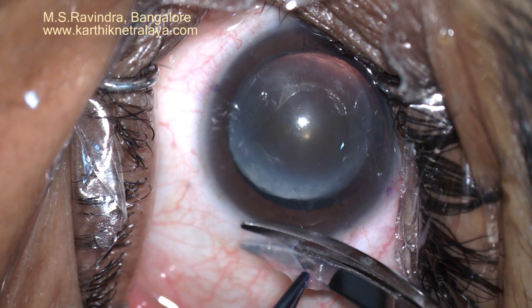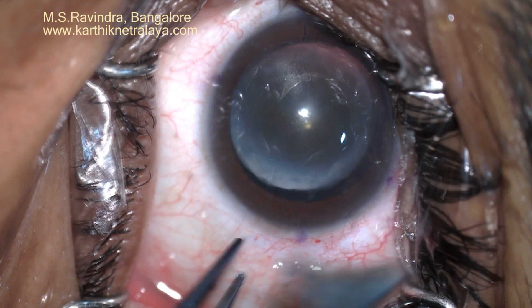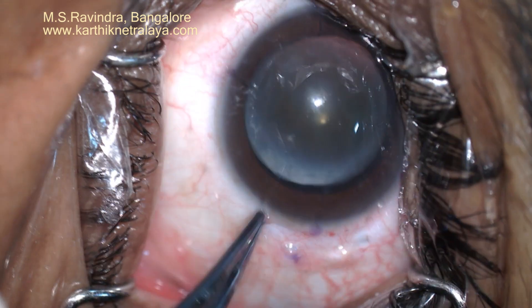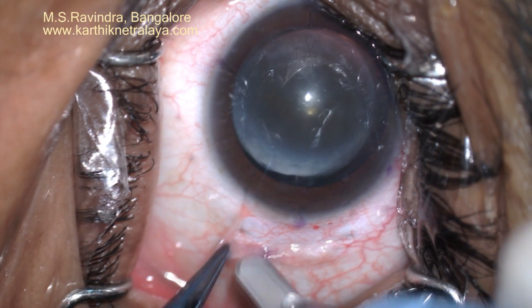A hydrophobic IOL of large astigmatic correction — a toric lens — was implanted in this eye to correct the corneal astigmatism.